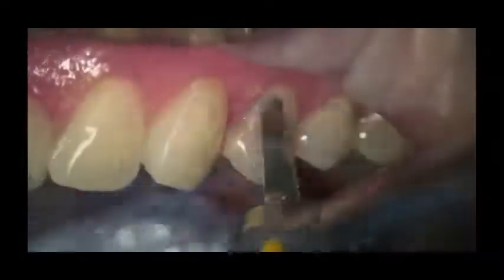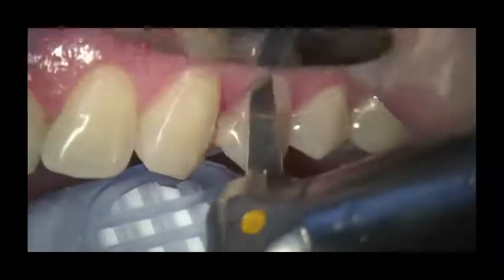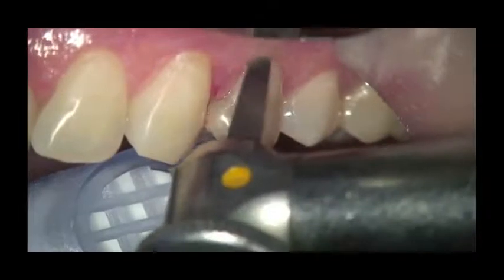And then this is a unique product that I use to finish the marginal areas. What it is, it's basically a little blade with diamonds on one side, and it's a fine diamond. You can get anywhere from coarse to fine tips, and it just moves up and down or back and forth. It doesn't rotate. So because it doesn't rotate, you can't gouge the root surface. So I use this to refine resin restorations at the gingival margins, and I also use it to remove resin cement around porcelain restorations, especially porcelain veneers.